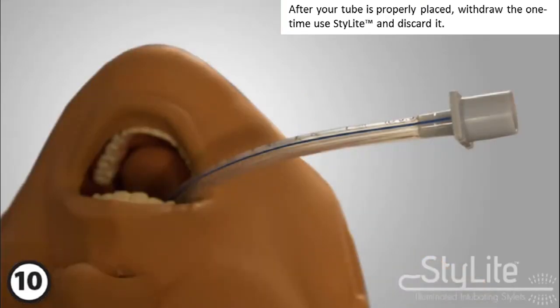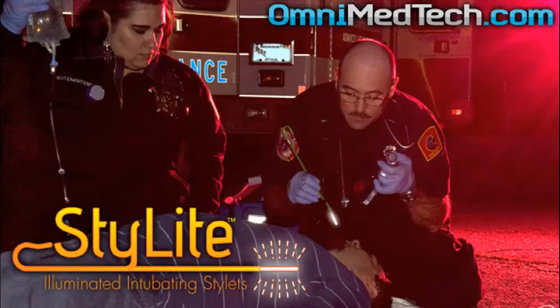You can learn more about the OmniGlo LLC stylet program at OmniMedTech.com.